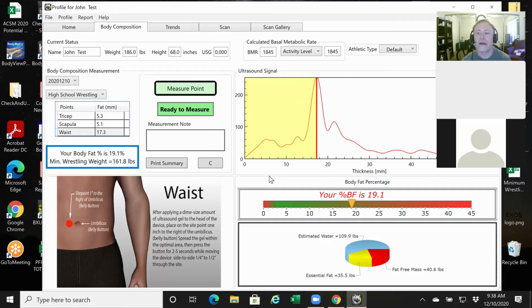It asked for like 5 different readings. It tops out at 5. He finally was able to get a reading. So I want to talk about this outlier case in the event that it comes up for you. So number one, he told me that because he had a protruding abdomen, it was hard to even get to the site point and he wasn't quite sure what to do.